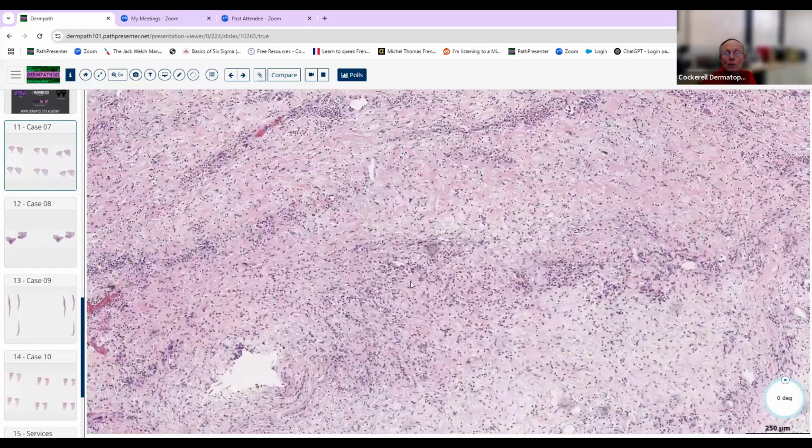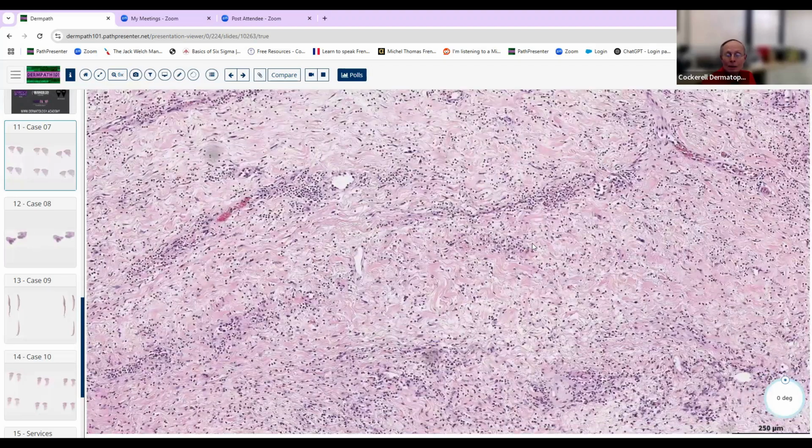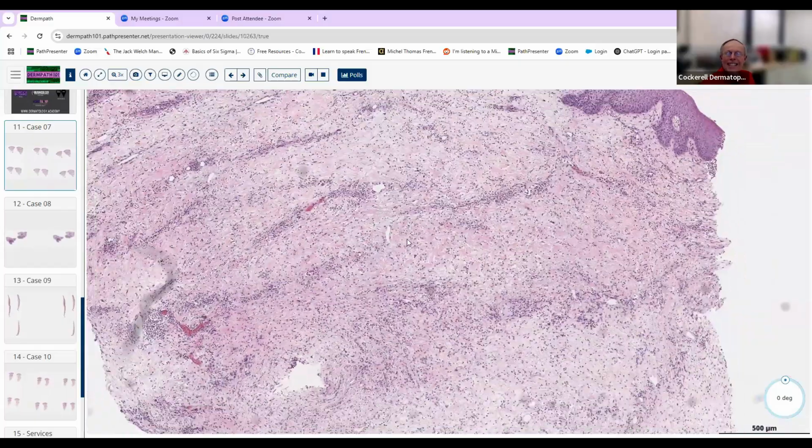Interestingly enough, even though this is almost certainly caused by bacteria, pyogenic bacteria like staph or strep, you do sometimes get some EOs in this condition, and the autoinflammatory conditions, which are associated with abnormal cytokines and things of that nature, you'd think they might have some EOs, but generally have fewer EOs. So if you see a biopsy of somebody who's got adult Still's disease, for example, you don't see any EOs in that, almost never. You see just neutrophils, and usually it's not quite as diffuse and dense as this.